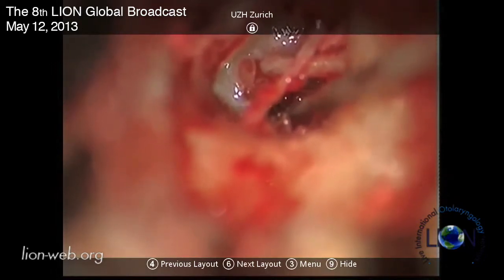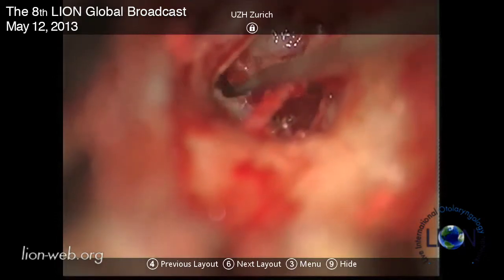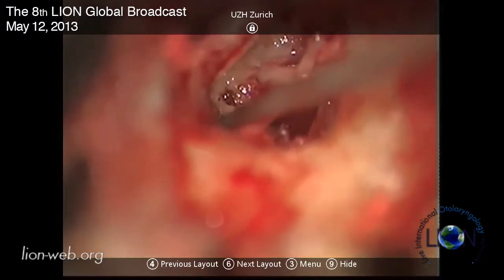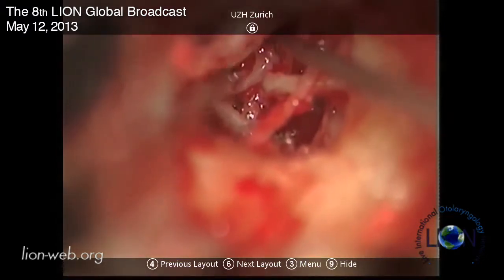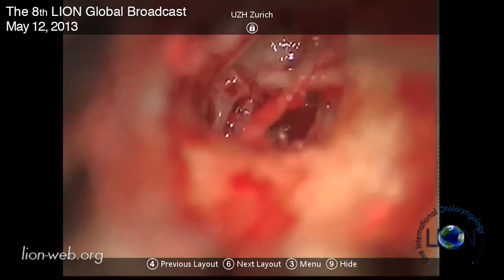I think it's important to at least try to cut the anterior crus. Now in some cases if there is not a very strong fixation you have some risk of actually getting a floating footplate.